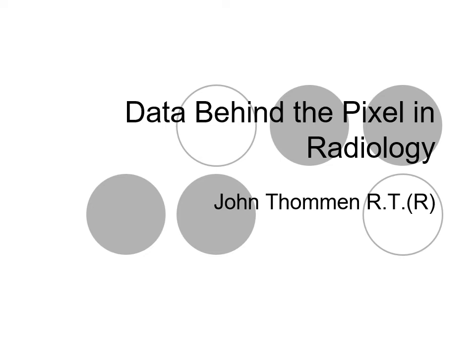In digital radiography, understanding what a pixel is only half the story. A digital image is constructed of millions of pixels, each displaying a color palette that ranges from black to white, with several intermediate shades of gray. Understanding how these colors are stored and displayed is crucial for the modern radiographer.